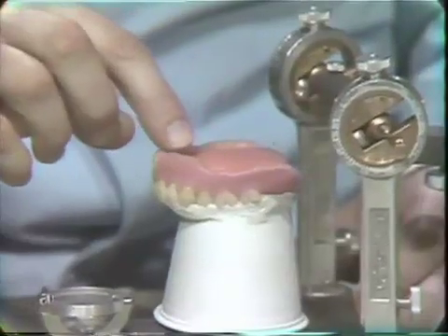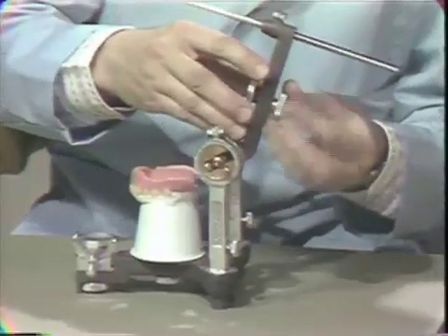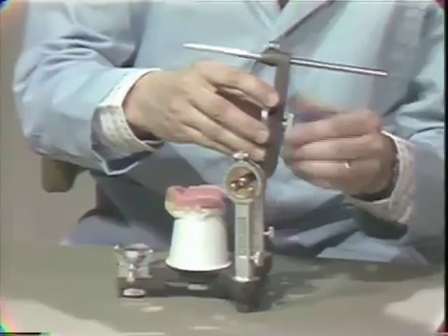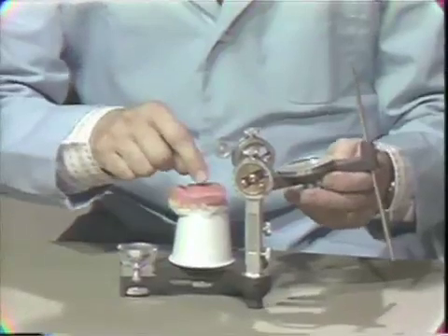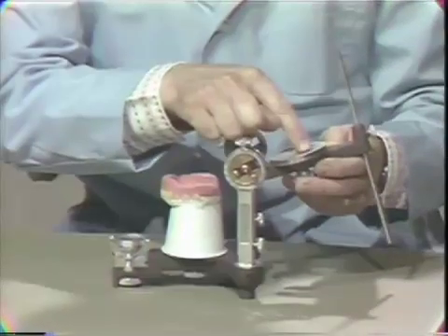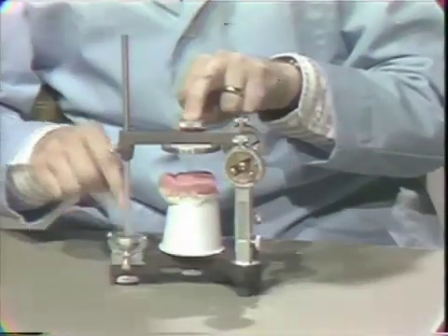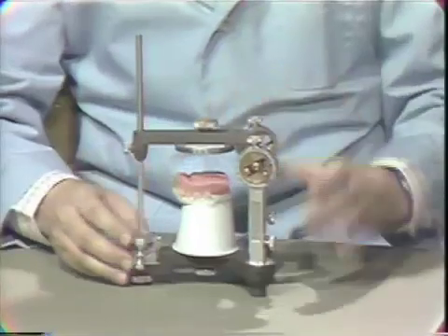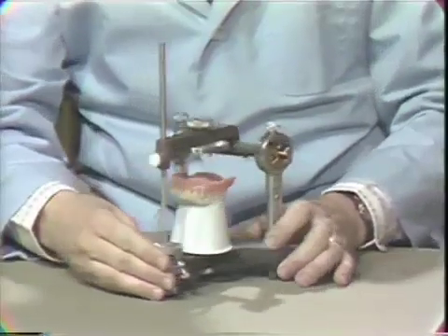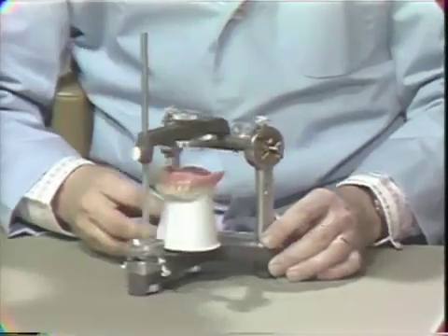We block out the undercuts and then we put a new ring on the upper and make a mix of impression plaster. Don't use stone because it will be very difficult to get out of the finished denture. Mix up the plaster and put it on this surface, then close the articulator making sure that the pin touches and letting the plaster set. Making sure that we don't get down onto the teeth because we do have to separate the denture from the plaster by hand when we're finished. This is just a simple way of making an index to maintain your face bow registration.